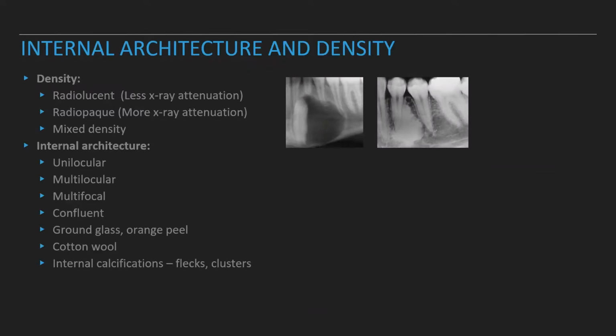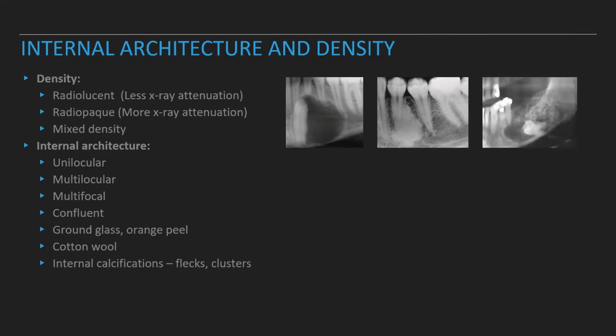The number one case I get a lot from my colleagues or my friends from dental school are dense bone island cases. They can be pretty large and they can cause root resorption. Are they mixed density again like this CEOT, Pindborg? I believe he said that if you wanted a lesion named after you, to make the lesion name very long, which is a calcifying epithelial odontogenic tumor. So most people might call it either a CEOT or a Pindborg.